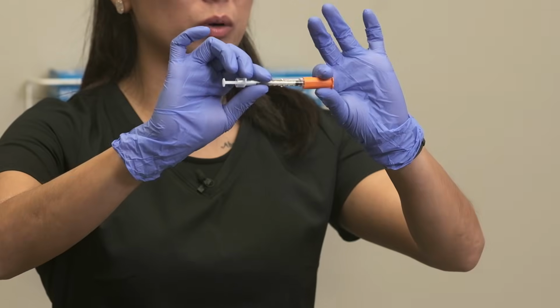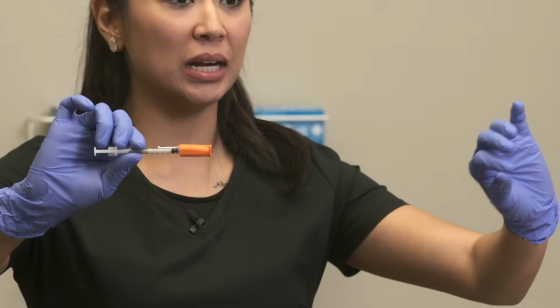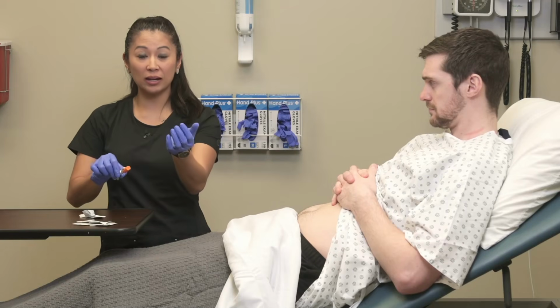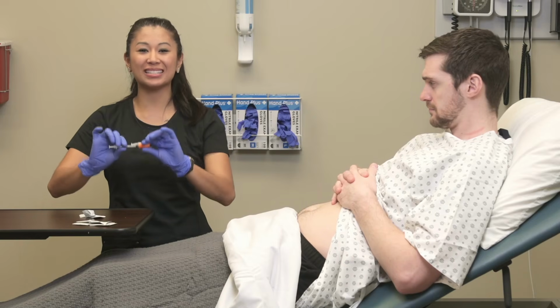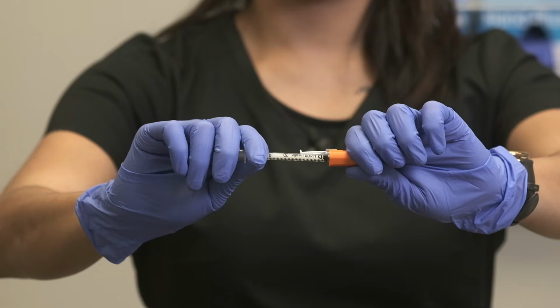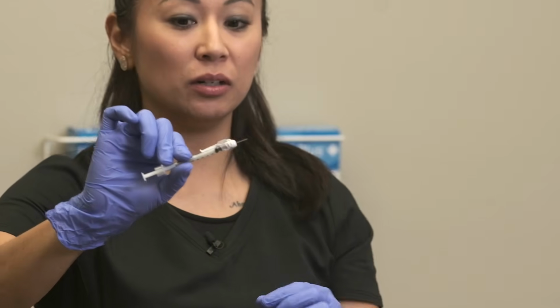Okay, so now we're going to remove our cap. Notice when I pull it away from my body, I pull it away from the patient. I'm not pulling it this way, where I accidentally stab myself. So please make sure you keep this nice and away from you and the patient. So I'm going to move this off and pull. We also take care not to bend the needle.